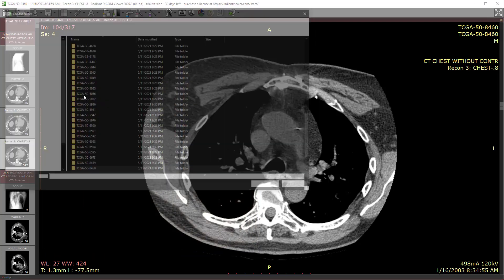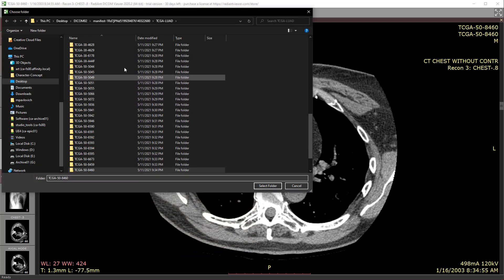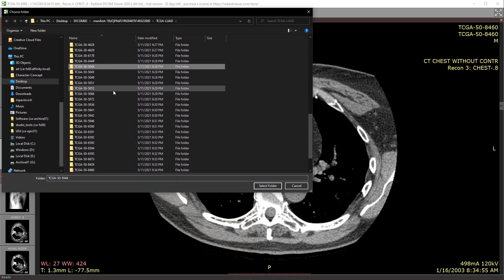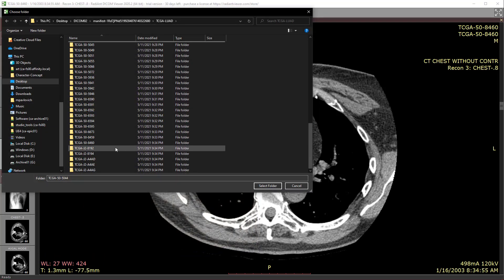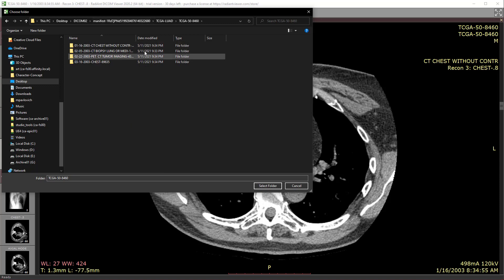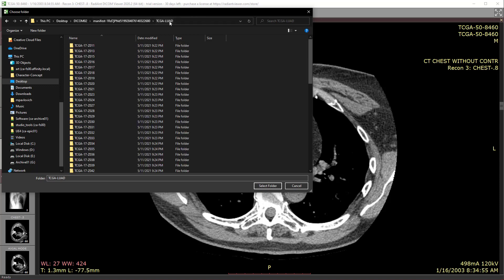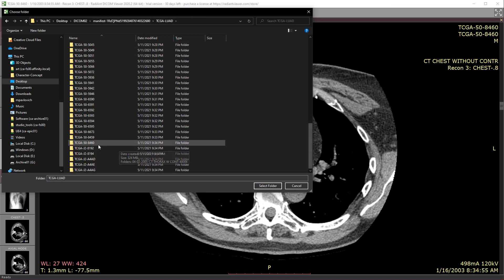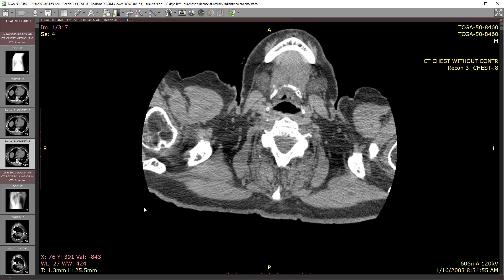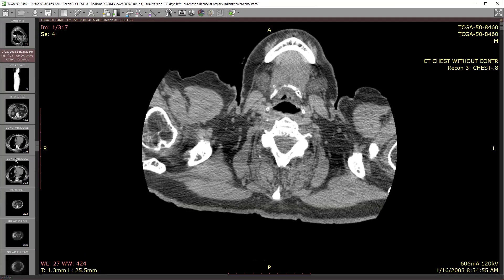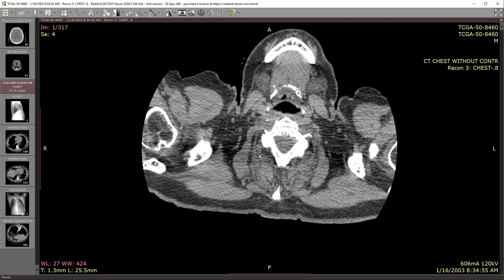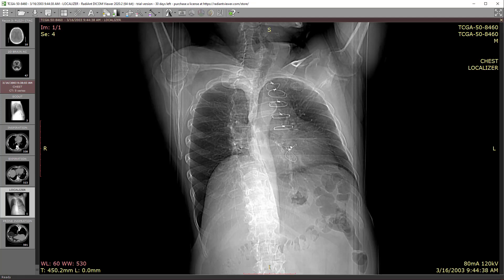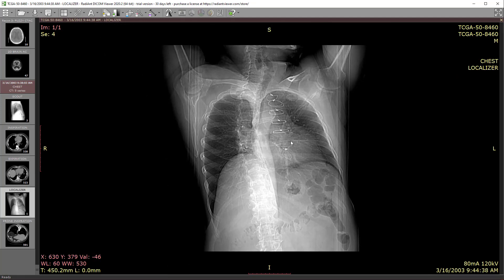All you need to do is open a file — for instance I've got these files downloaded, so I can pick one. Going one directory higher shows all of them. Just choose the folder and select it to load everything up, then over here you can scroll through the different datasets.